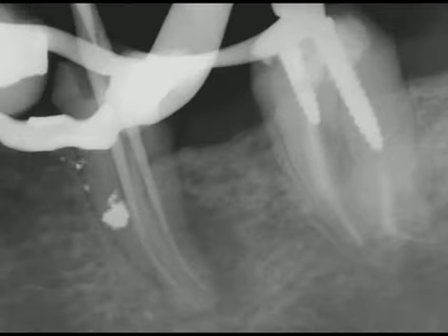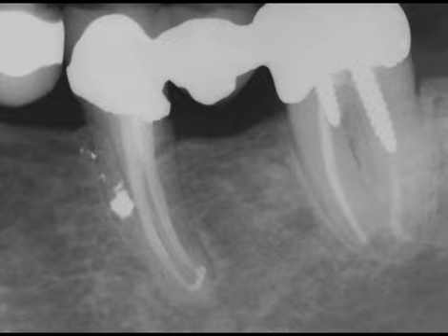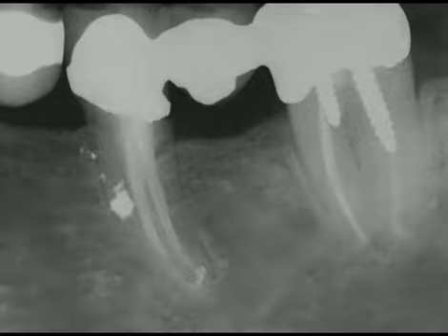A subsequent working film demonstrates 2 instruments negotiating the MB and ML systems and at length. This working film shows 2 gutta percha cones at length in the MB and ML systems. A post-treatment radiograph reveals 3-dimensional retreatment. Note the third mesial system between the MB and ML canals with its own apical portal of exit. The 8-year recall film demonstrates a new bridge and excellent periradicular healing.